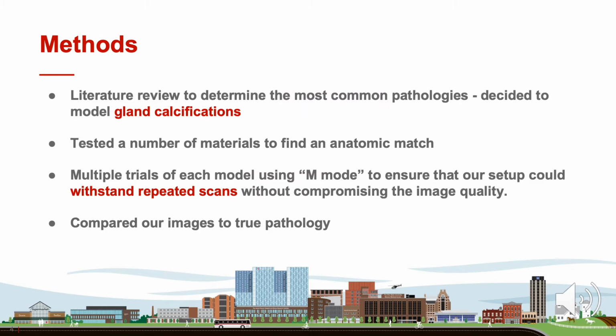Our methods included a literature review to determine the most common pathologies. We decided to model parotid gland calcification specifically. We tested a number of different materials to find an anatomic match, both in terms of ease of use with the ultrasound machine, as well as whether or not it was representative of actual pathology in human patients.